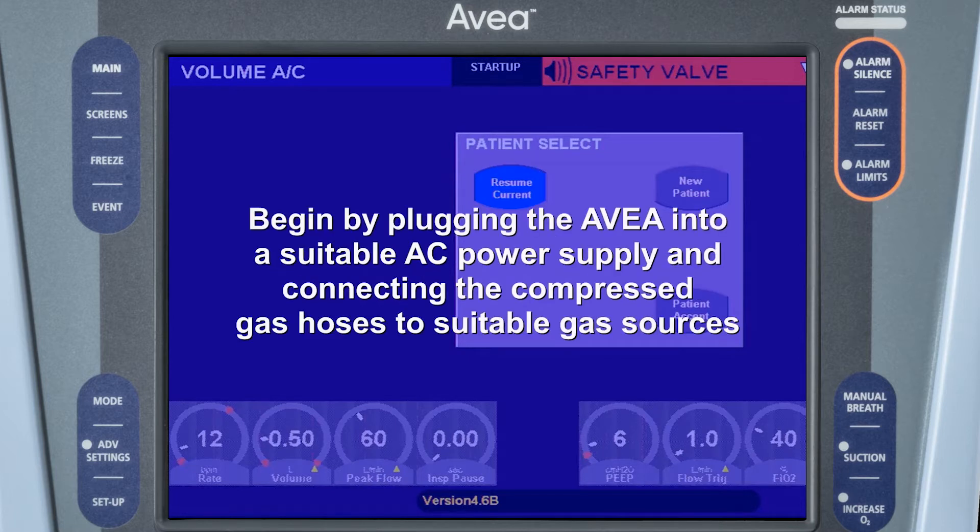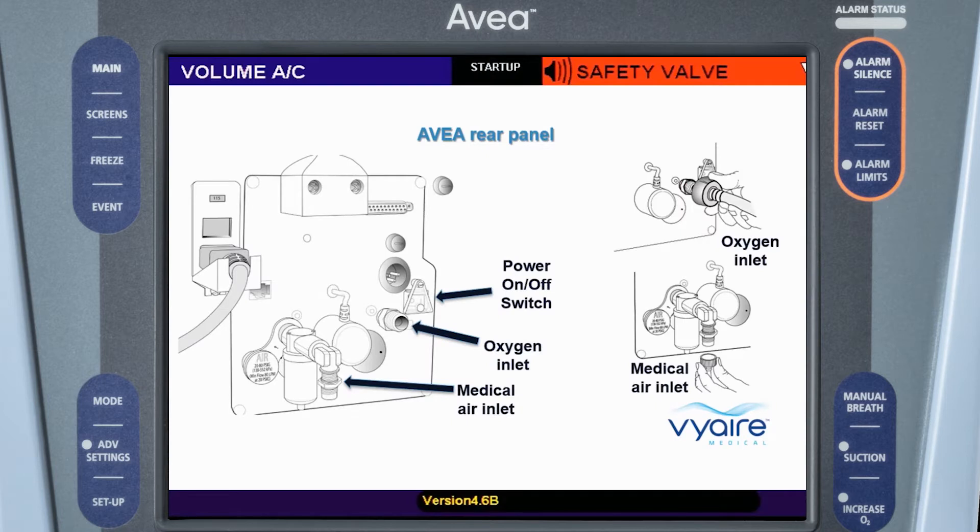Begin by plugging the AVEA into a suitable AC power supply and connecting the compressed gas hoses to suitable gas sources. These gas connections can be found on the rear panel of the AVEA near the main power switch, which is used to turn the ventilator on and off.